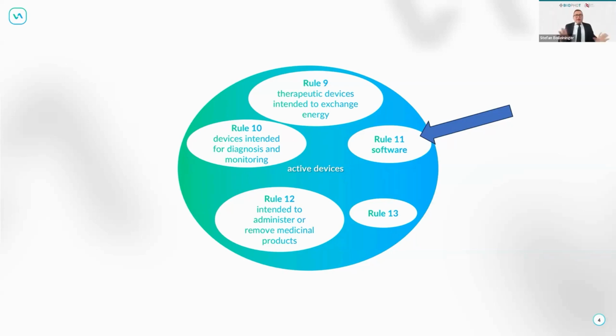If you have a multi-platform usage for a different set of patient monitors, or a control platform for dialysis machines, or a control platform for infusion pumps, that would be software defined in its own right. It would be its own product because the infusion system, the dialysis machine, or also the patient monitor work on their own. They are independent.